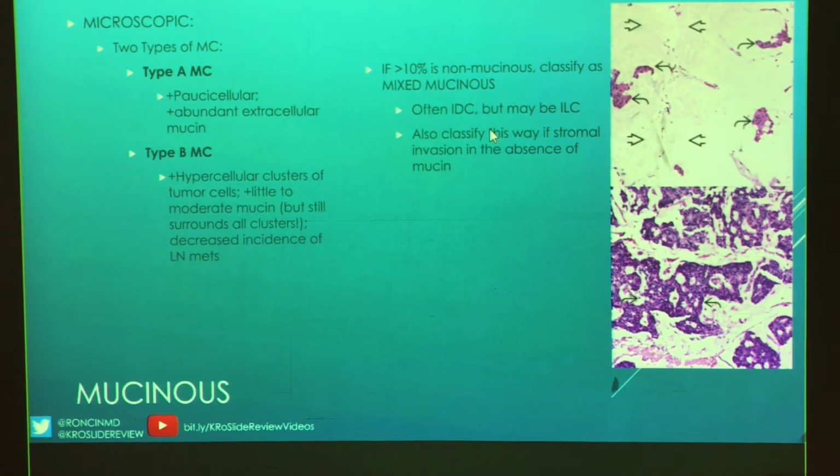Also, again, we don't have a desmoplastic response. So if you have stromal invasion in the absence of mucin, then you also want to classify it as a mixed mucinous tumor.